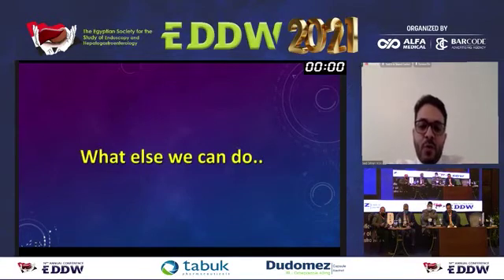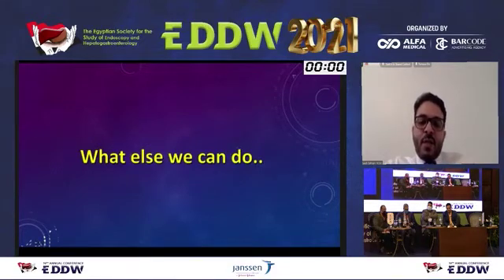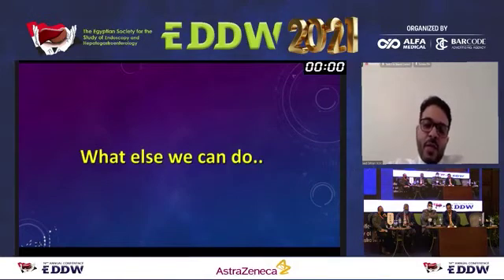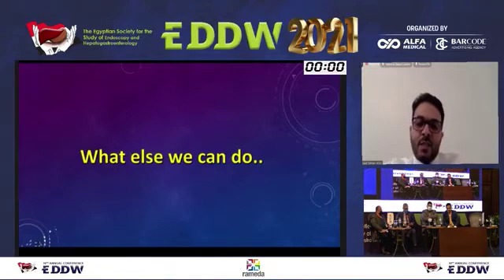So if you do all these tests, you will diagnose most of the pancreatic cystic neoplasms. However, as we mentioned, all these tests are suboptimal, and you will be left with a few cysts. You call them indeterminate cysts, and you want to do something else. So here are a few tests or technologies that you could use for now, but we still need more studies to tell us when to use them and how to utilize them.